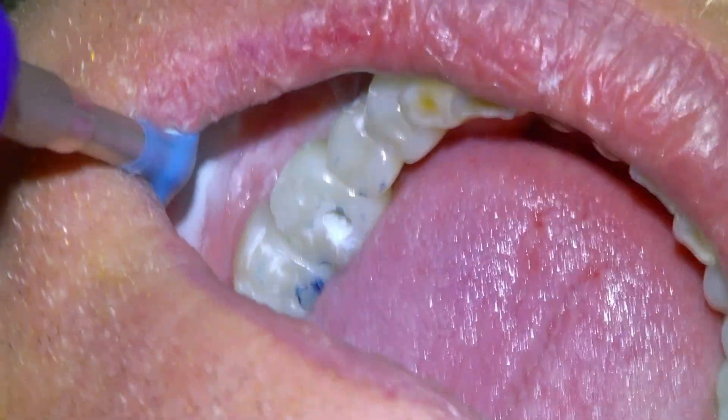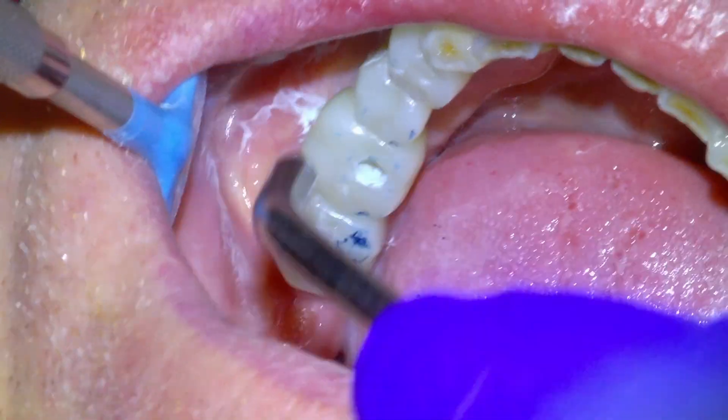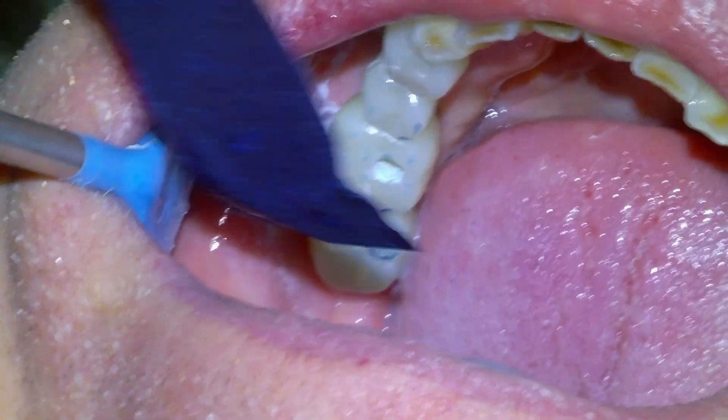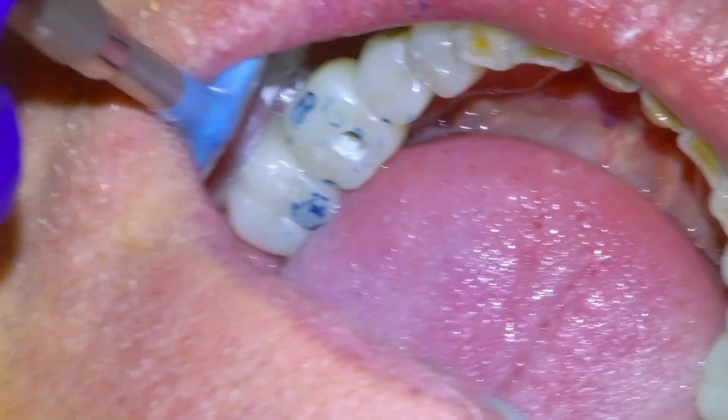How does it feel when you bite and grind there? Just your impression. Little ways to go still, or maybe a little bit. Okay. Bite and grind, and open. Good. Yeah, just on that outside edge.